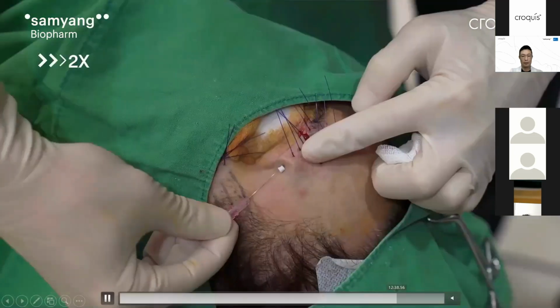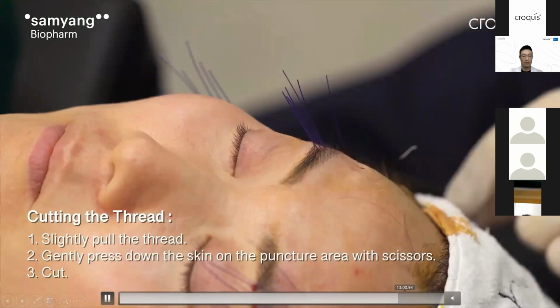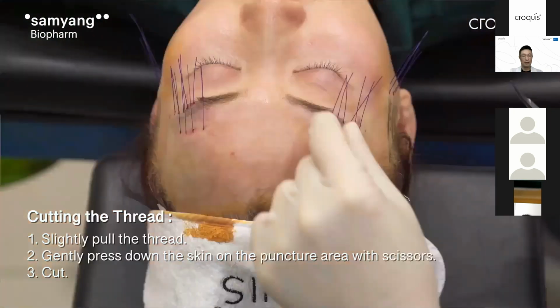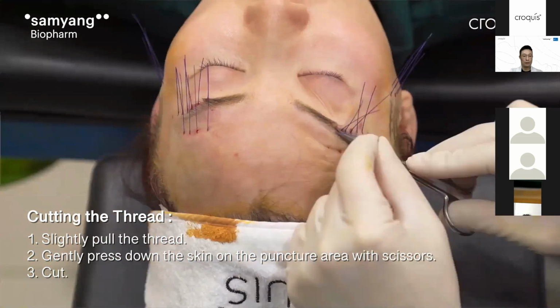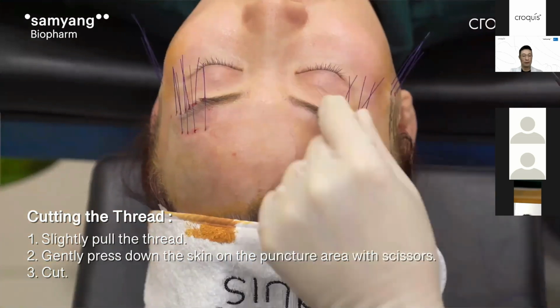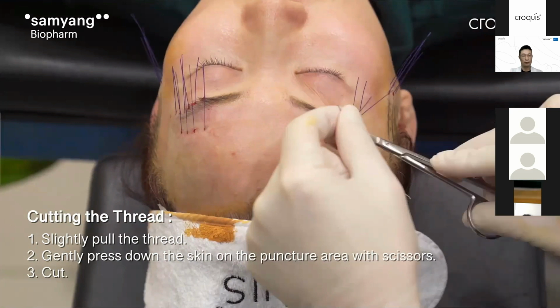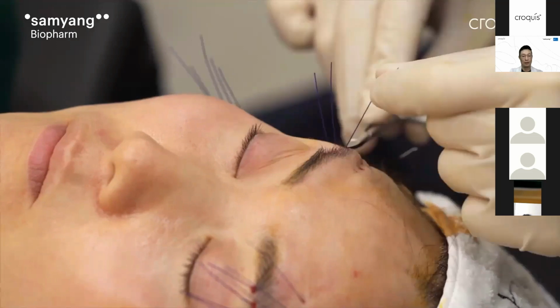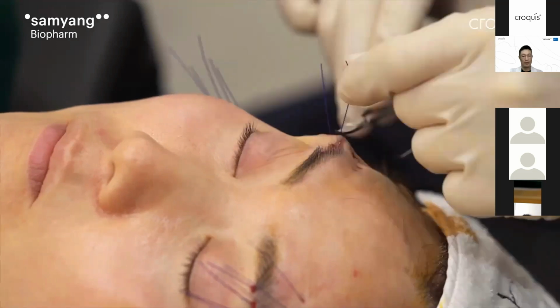Okay, so when cutting the threads, just pull a little, because if you pull too much, the thread could come out and the lifting effect will be reduced.